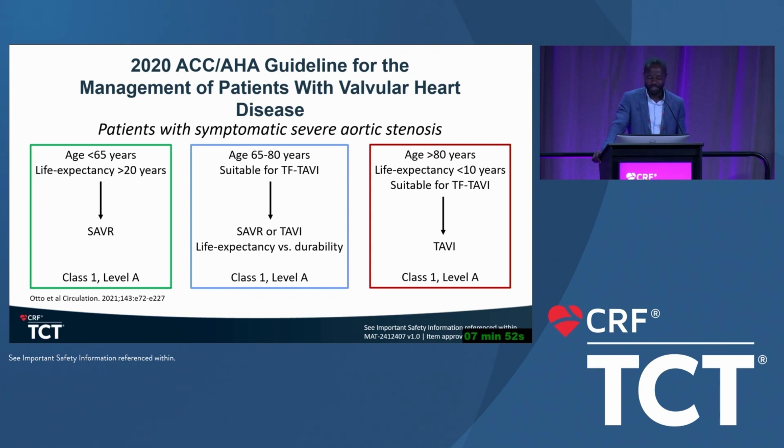Doing these aortic valves, the procedure itself has gotten pretty standardized and relatively, I don't want to say easy, but standardized too. For us in clinic, the thought process has gotten way more complex than one might think, being that aortic stenosis is one disease process, and I'm saying this in relation to mitral valve disease and tricuspid valve disease. But we are way more tired in our TAVR clinic because you're thinking of way more things. Now you have to think about, okay, what valve? How long are they going to live? What happens when you put the second valve in? And your poor little imagers are over there doing 45 minutes of recons trying to figure it out so that we can see into the future.